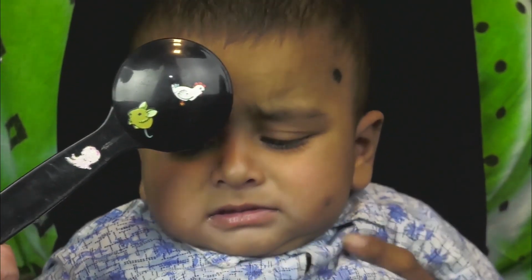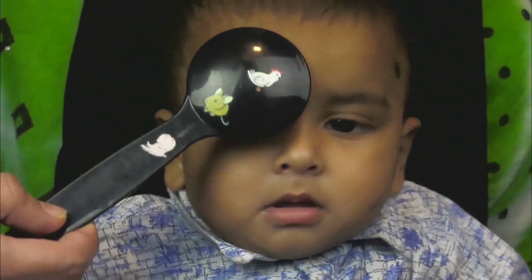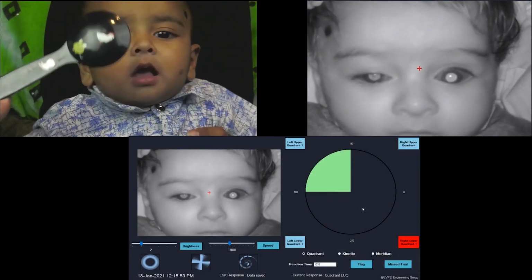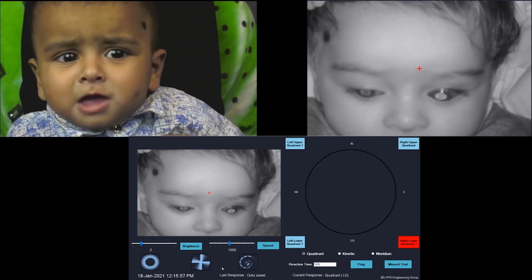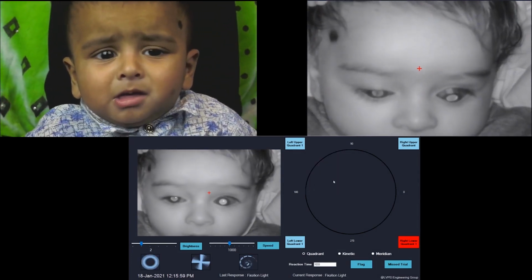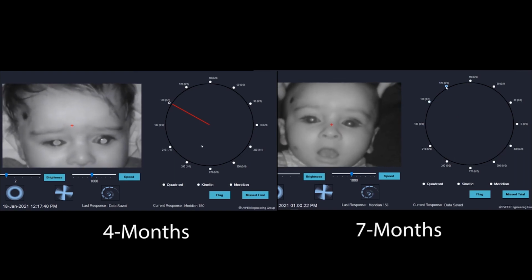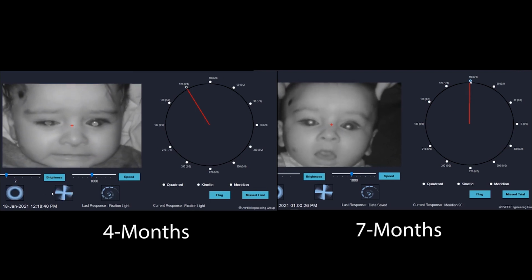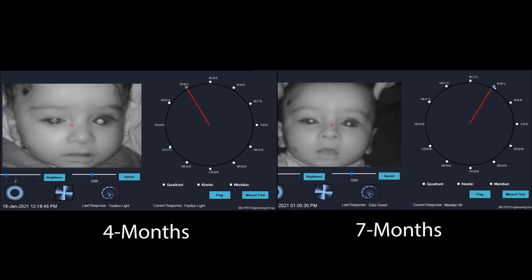Pediatric eye examination is challenging because of lack of cooperation and shorter attention span in infants. The presence of congenital ptosis in younger infants might predispose to superior visual field defect and could also masquerade as a limitation in elevation. This video highlights the use of the pediatric perimeter device for unraveling the mystery of congenital ptosis and monocular elevation deficit in an infant, which is challenging in a routine clinic.